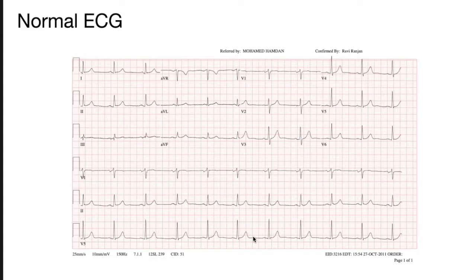They're different leads, but that's not time sequential. They're all occurring at the same time. If you want to look at something more continuous, you look down here. You want more than one, but this isn't a continuation. It's the same time. You can stack them all up vertically, and if it's done properly, they'd all be time aligned.